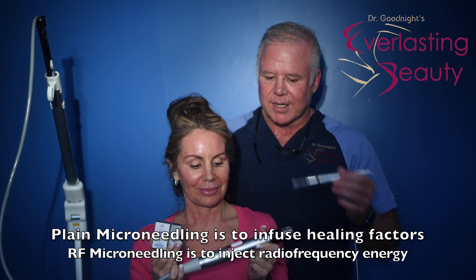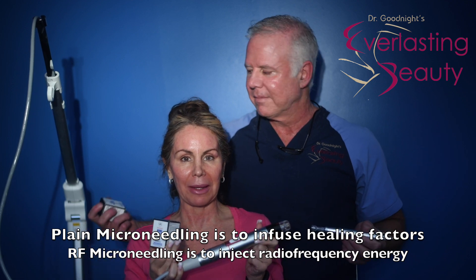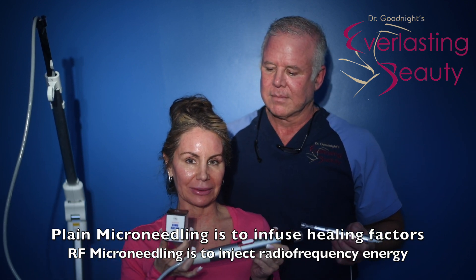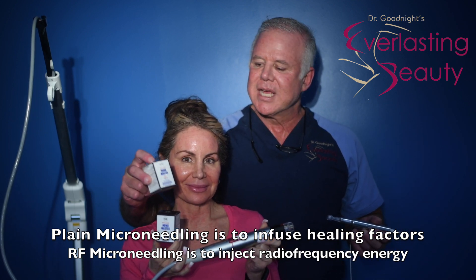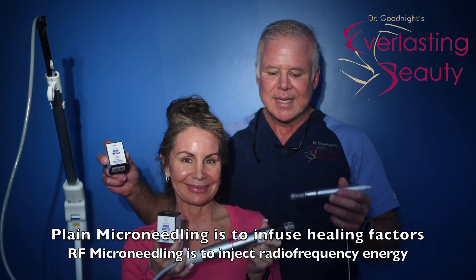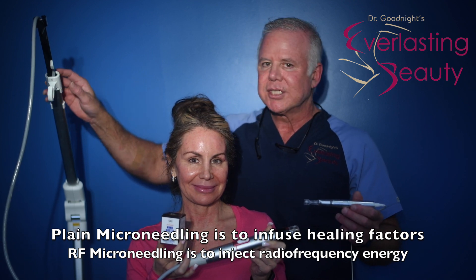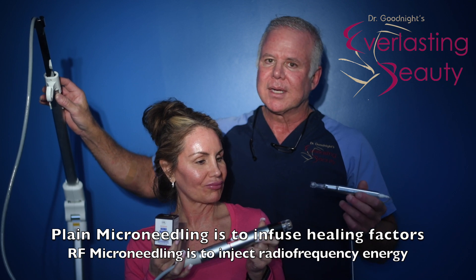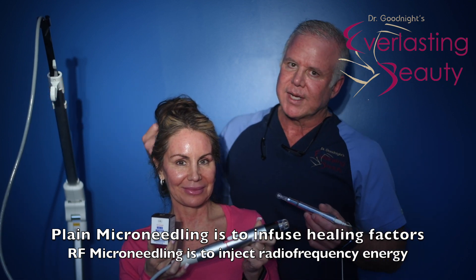But she did something different. A few hours ago I did RF microneedling. Mine involved that same jar of numbing cream — I put a first application on, and then a second one, so for an hour and 15 minutes she had so much numbing on her she looked like a carrot cake with icing. But that's what made it painless, because the machine injects radiofrequency energy which without numbing would be uncomfortable. With it, it's fine — and as you can see, she looks fine as well.